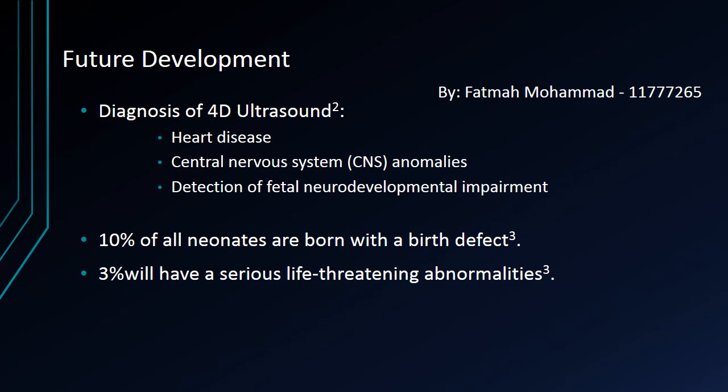Additional research is needed to determine the clinical utility of 4D ultrasound for several purposes, like the diagnosis of congenital heart disease, central nervous system anomalies, and detection of fetal neurodevelopment impairment that is assessed by abnormal behavior in high-risk fetuses.